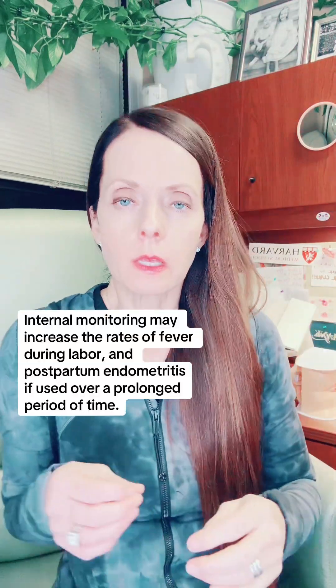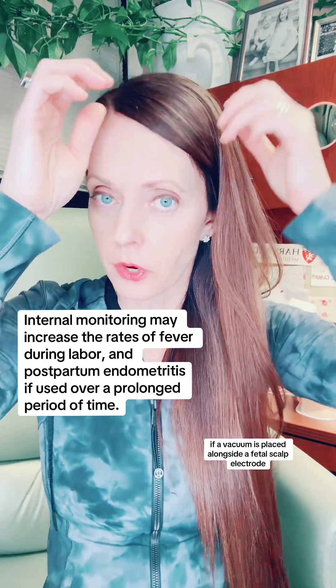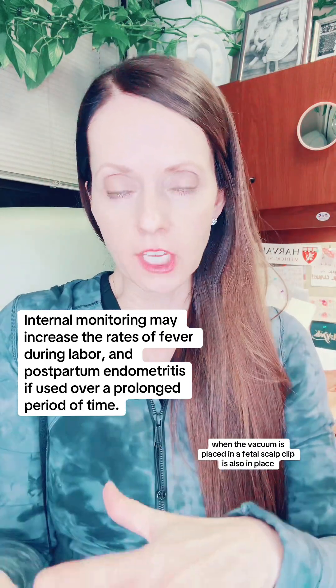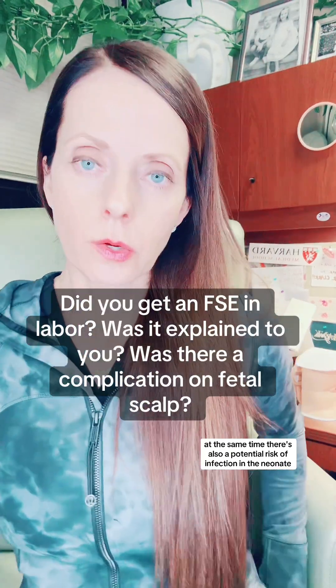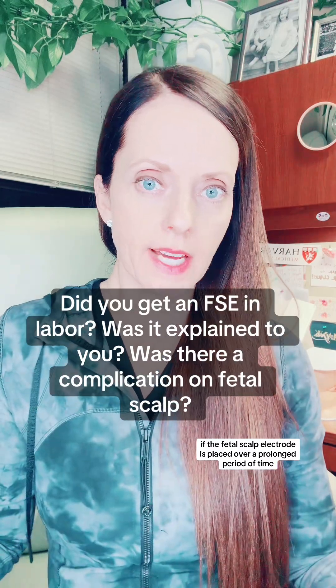The most common complication would be a hematoma where the scalp electrode was placed. You can also have temporary hair loss there, or a little bald spot, which I've seen happen before. There can be other complications if a vacuum is placed alongside a fetal scalp electrode — in fact, that's when most of the more significant complications occur. There's also a potential risk of infection in the neonate if the fetal scalp electrode is placed over a prolonged period of time.